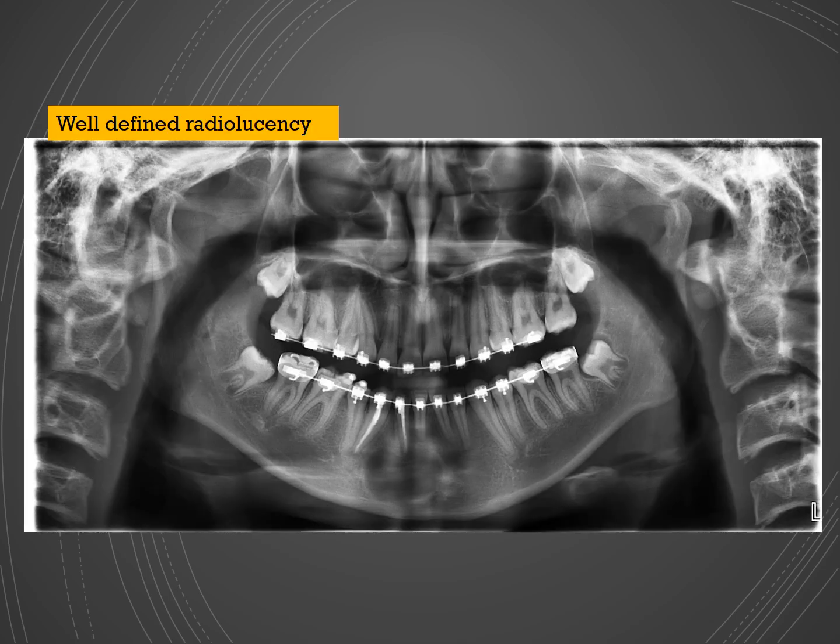Of course, panoramic radiographs are excellent imaging for patients who have to wear braces, who are indicated for orthodontics, and post treatment as well. But sometimes during the treatment, you get unexpected issues like these.